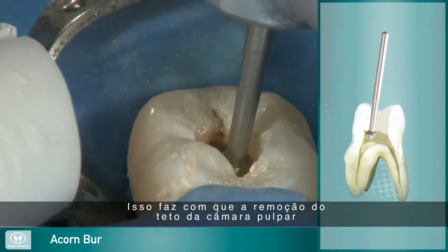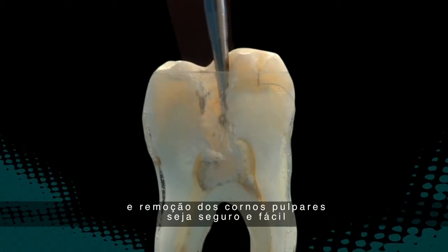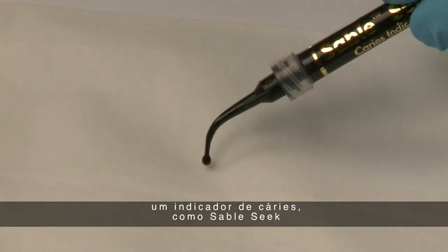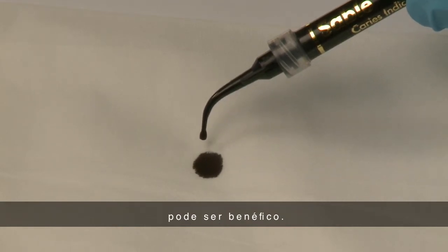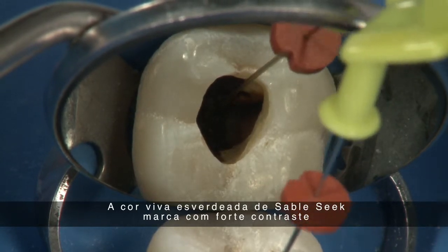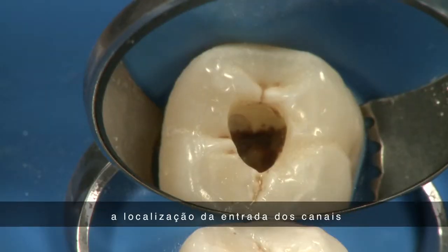This makes de-roofing the pulp chamber and removing the pulp horns safe and easy. To identify difficult-to-find canal orifices, a quality caries indicator such as SableSeq can be beneficial. SableSeq's bold green color stands in stark contrast to pulp tissues and readily identifies the location of the canal orifice.